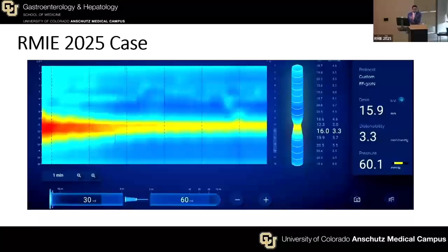So after we finished the myotomy, we have now incorporated EndoFlip in our practice. And there's two reasons for that. One is that because we're doing tailored short myotomies, that's significantly reduced our procedure times, but we want to make sure that we're not leaving residual disease behind. So intraoperative EndoFlip prior to closure allows us.